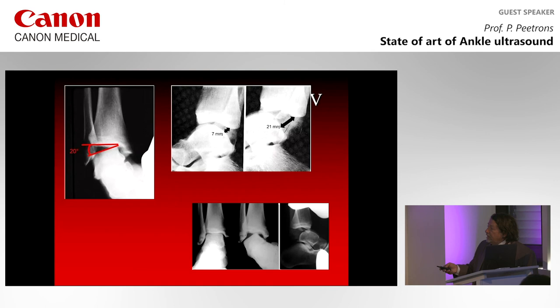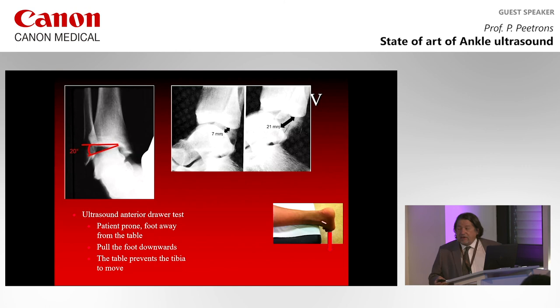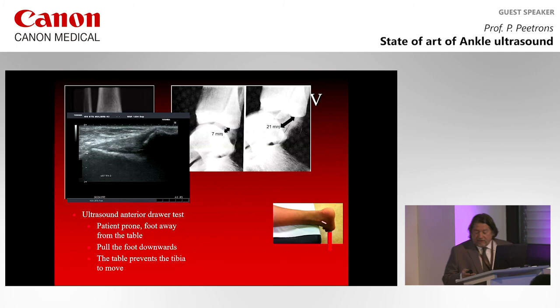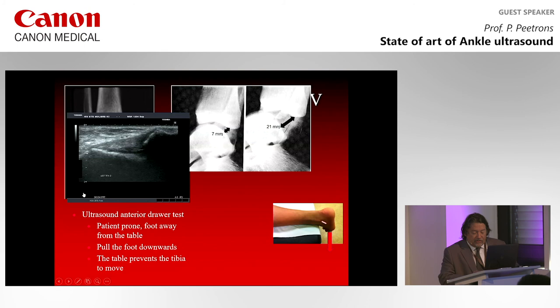So what we do in ultrasound is putting the patient prone and putting his tibia on the table. So the table is doing what your hand is doing on the tibia in X-rays. And then we pull the foot downwards, and the table prevents the tibia from moving, and we see the movements of the ATFL, and we see the movements of the fibula and the talus. This is an example of a normal ATFL.